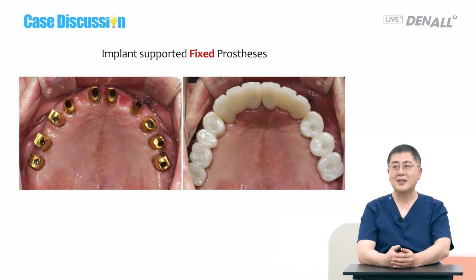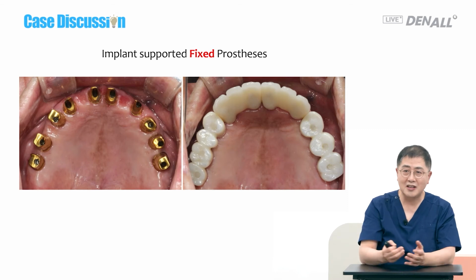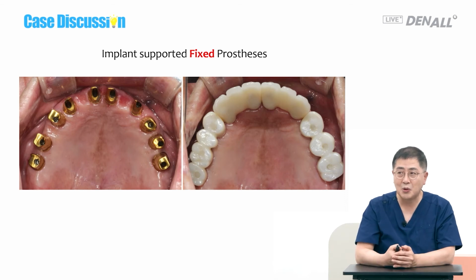For the case under discussion, if you place many implants and make a fixed prosthesis, and if it provides lip support, it would be aesthetically very good too. But we cannot do this in many cases. If the denture has been used for a long time, it's not possible to do this. As a prosthodontist, I cannot do GBR as good as our masters here, so I have to choose something else.